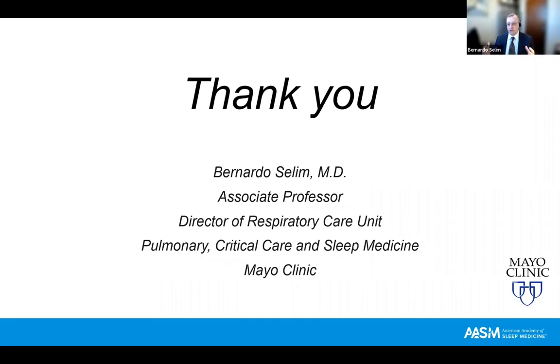The higher the delta pressure, the higher is the leak. So for example, if you have a high intensity patient at, let's say, 25 or 27 inspiratory pressure and an EPAP of 5, I'm not going to be expecting a 25 or 20 liters per minute leak. I'm going to be expecting 30 or 40, because this is a huge, humongous amount of pressure. So the leak is a balance in which the patient can tolerate. It is known that it's going to be higher when you are having a large delta pressure.